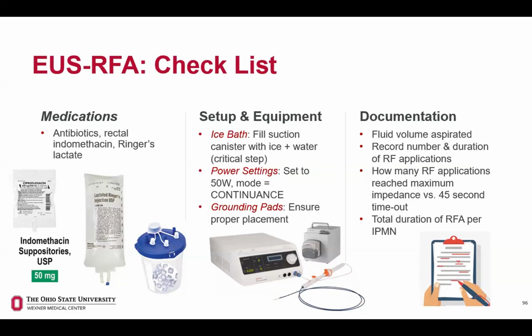The power settings for this are 50 watts. And again, that's something which has to be standardized under a continuous mode. And make sure the grounding pads are placed properly. The most critical aspect is documentation. We strongly encourage doing RFA on a clinical trial basis. So you document every aspect of the ablation, the amount of fluid you aspirate before ablation. You record the number of ablations and how many of them reached impedance, how many of them maxed out to 45 seconds, and also the total duration of RFA.